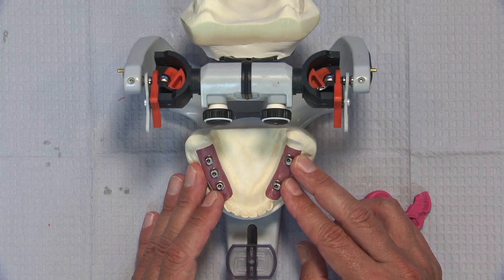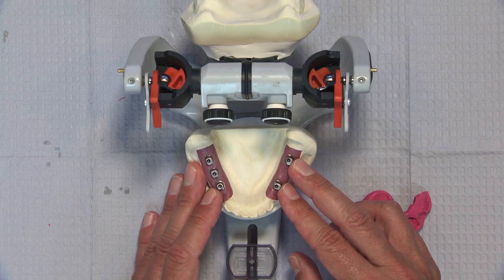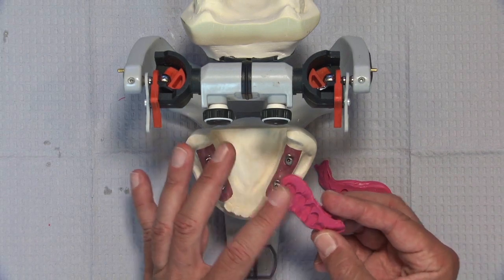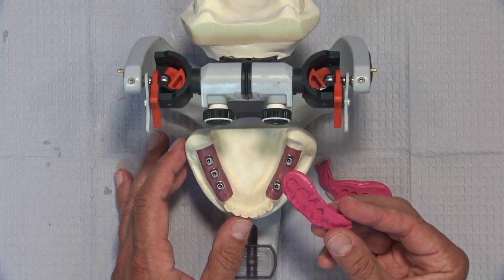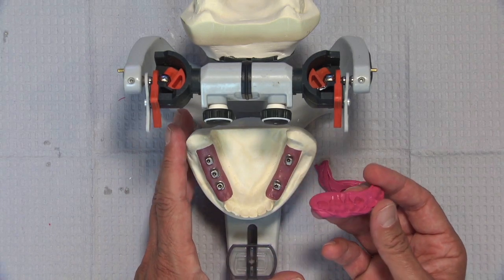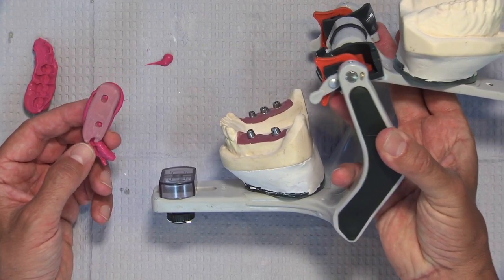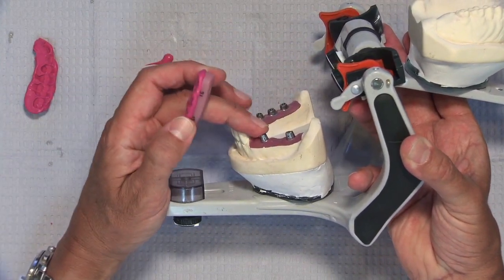So we can send you duplicate abutments, and then you'll have a biotemp bridge that you can cement on top of that. You'll have a small occlusal adjustment probably to make on that biotemps bridge, just the same way that we had to grind some of the anatomy off the bite index before we did the bite registration. But that's another way to be able to provisionalize this patient with something fixed like a biotemp through the use of these duplicate abutments.